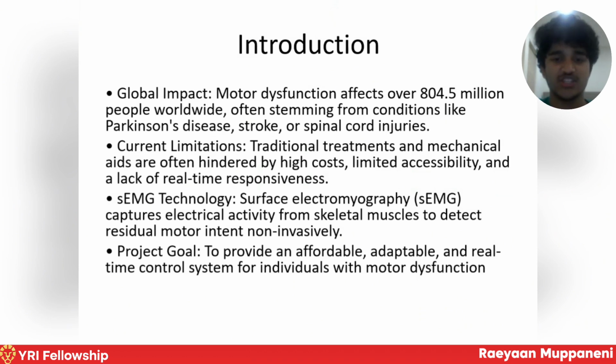The current limitations in the field right now are that the traditional treatments and mechanical aids are often blocked by high cost, limited accessibility, and a lack of real-time responsiveness in the devices.